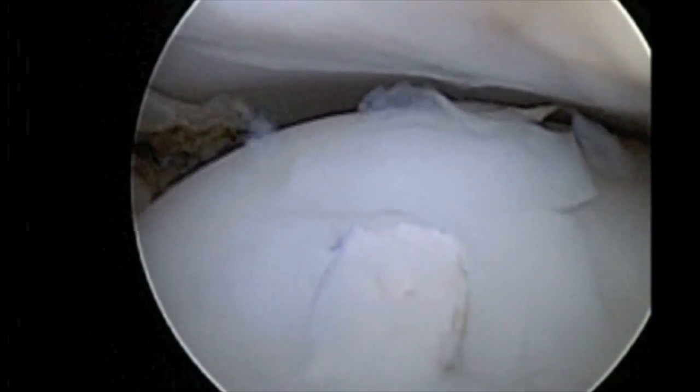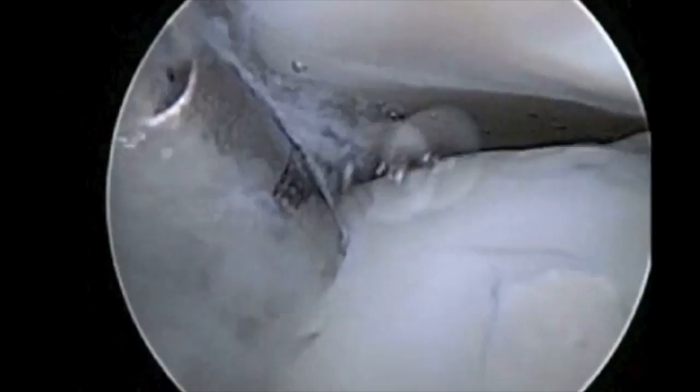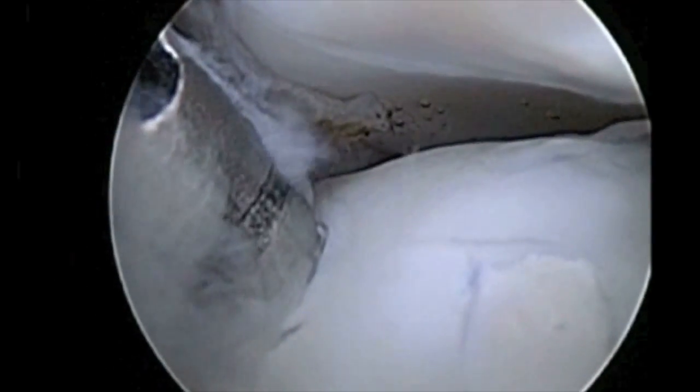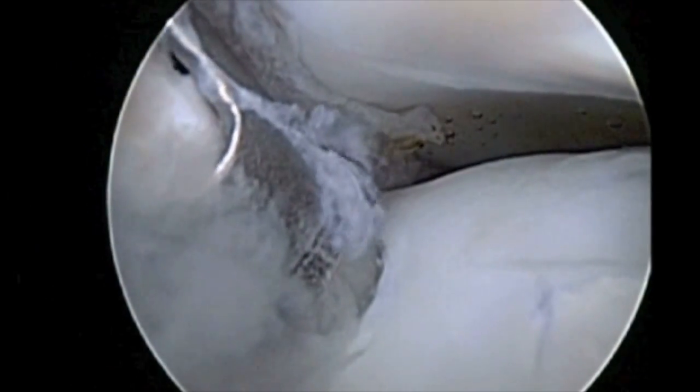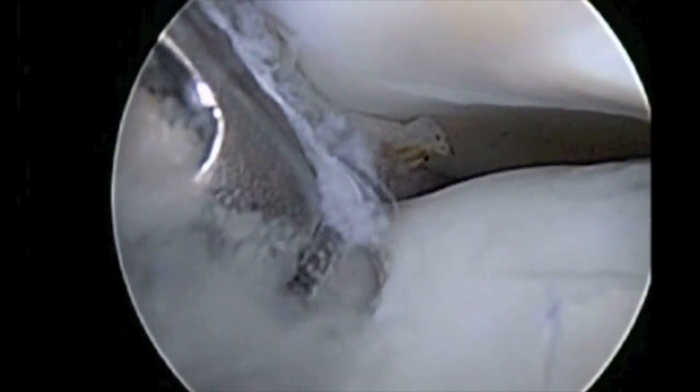Finally, HAPLA thread pins were inserted to fix the OCD region. A second thread pin was then inserted to secure fixation in this case.